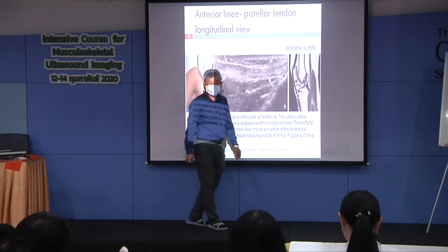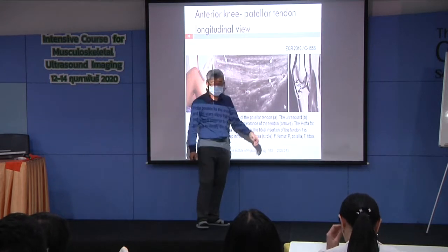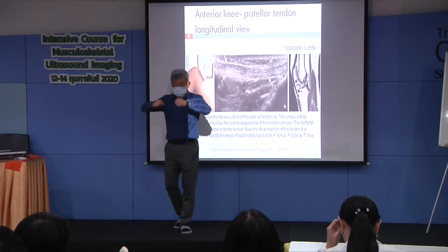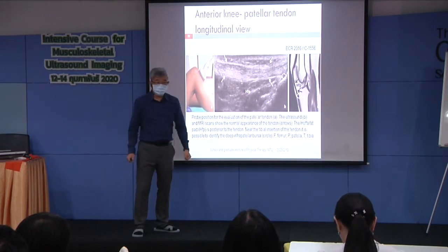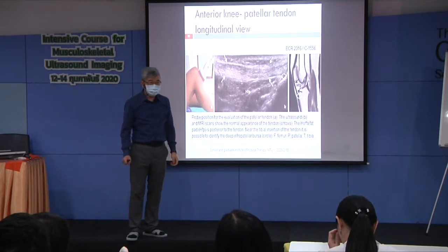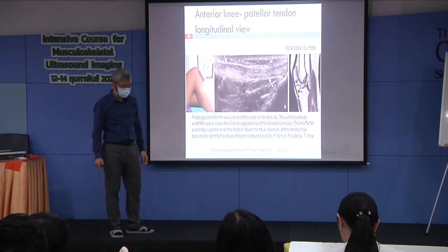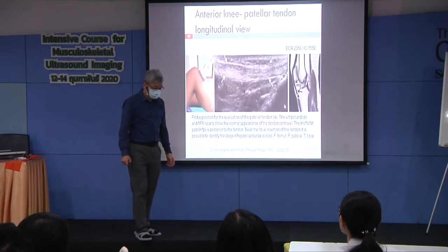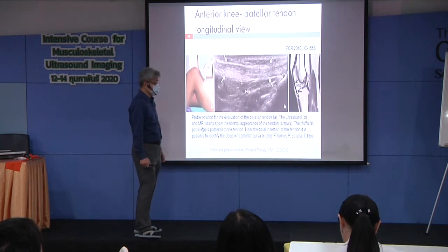Bridge-like patellar tendons. It means the patellar tendon is not stretched. Okay, a friend of mine at USC, Professor Wang, showed me, we are doing some study on the patellar tendon. Can you confirm the image quality is good?